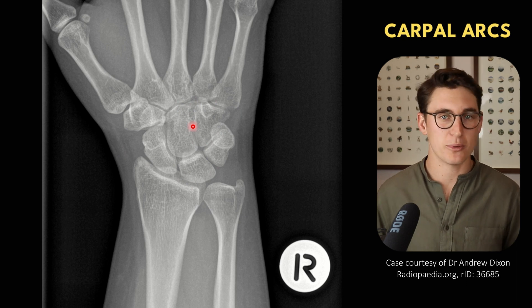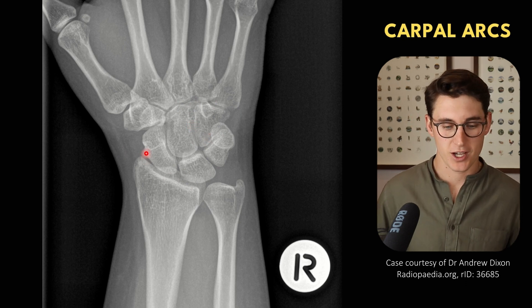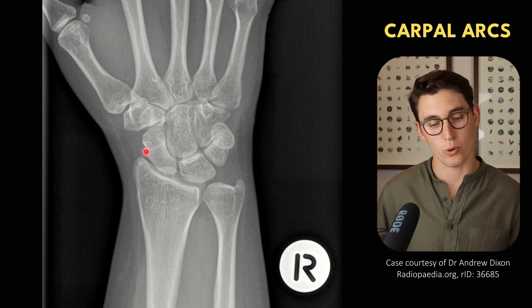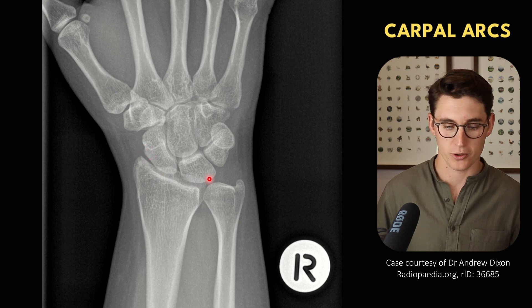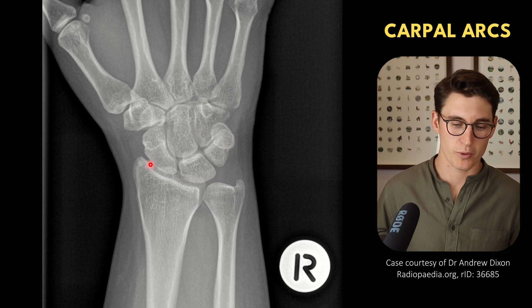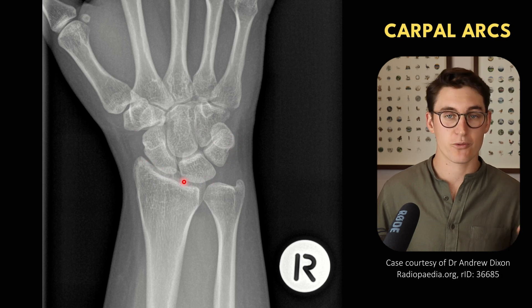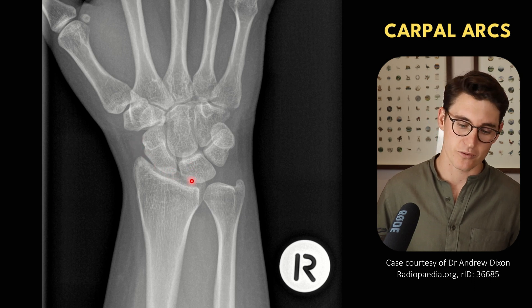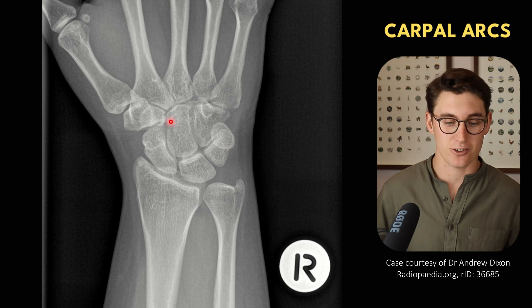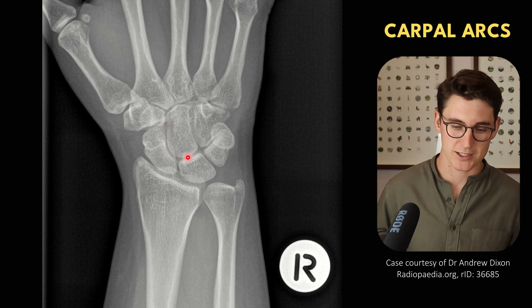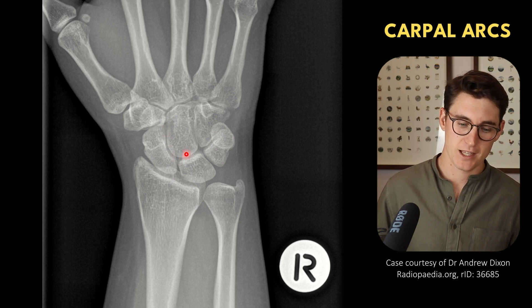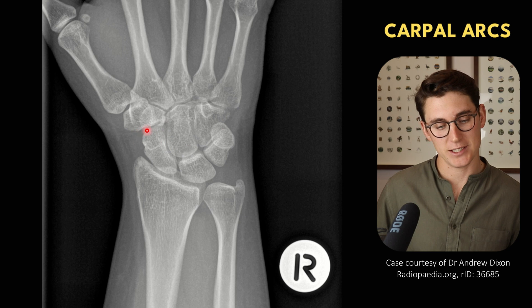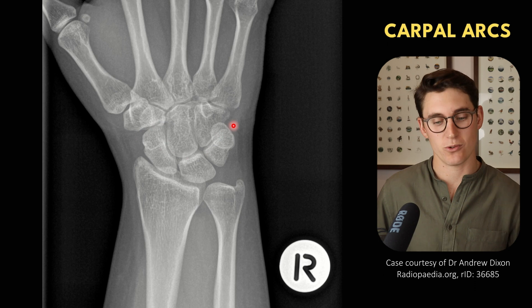We can then look at what's known as the carpal arcs of the wrist. We have a carpal arc coming along the proximal border of our proximal carpal bones — we should see a smooth arc forming all the way around. If there are fractures or dislocations, we could have disruption, step-up, or step-down deformities of this carpal arc. We can also look at the distal row with a nice smooth arc between the capitate and the hamate, and some people also continue the arc between the trapezium and trapezoid bones.